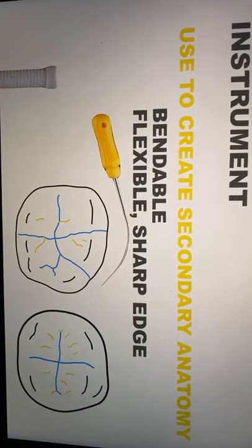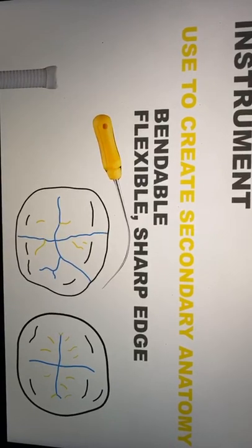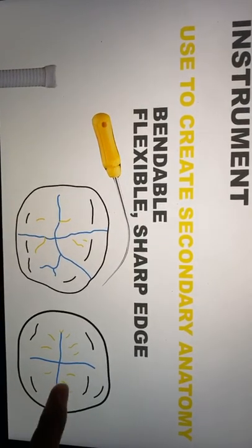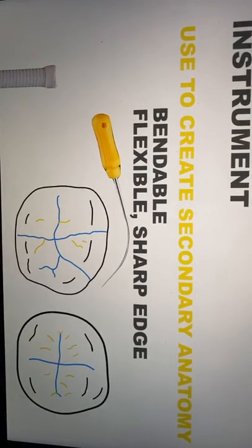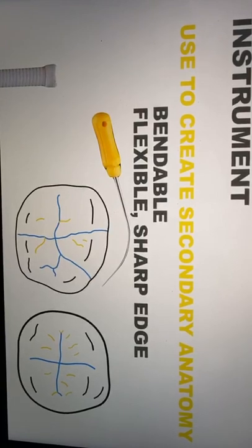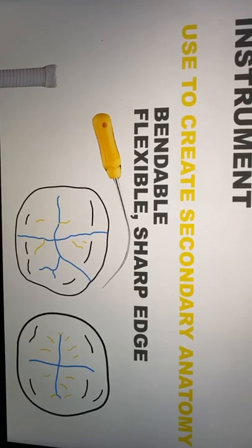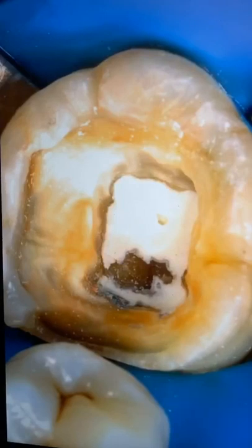So this one is to create the secondary anatomy. You see, if you can see my Instagram posting, you know my characterization for carving is a very complicated secondary anatomy. I created it with the help of this yellow instrument. You see the yellow picture here, I created with the help of the yellow instrument. Actually, the secondary anatomy is not mandatory to recreate, but if you can make one, it will enhance your aesthetic result for the posterior. So this is how I use it.